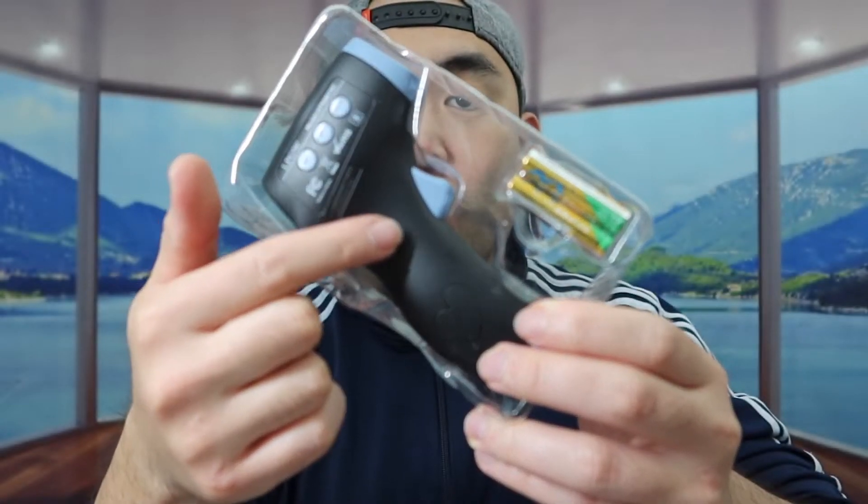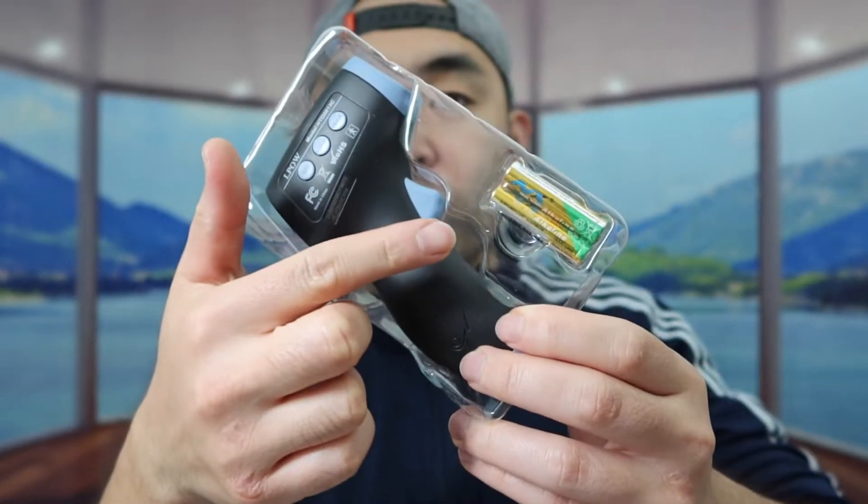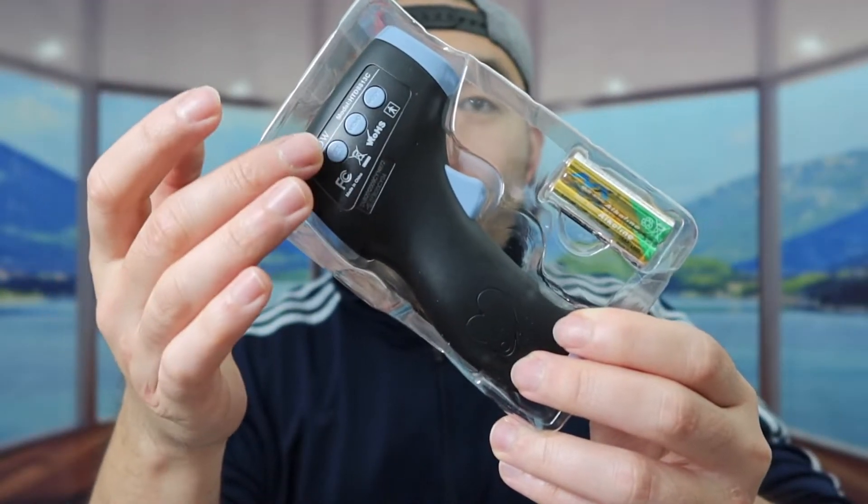For the batteries, you do have the option to use your own if you guys want to, or you can use the ones that are right here. So first, let's take out the product.